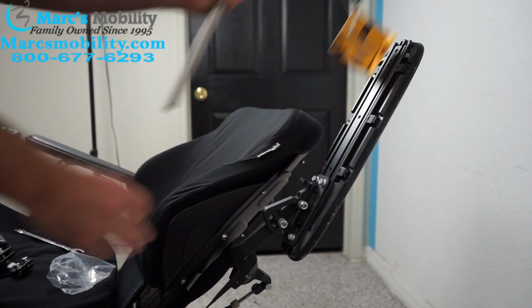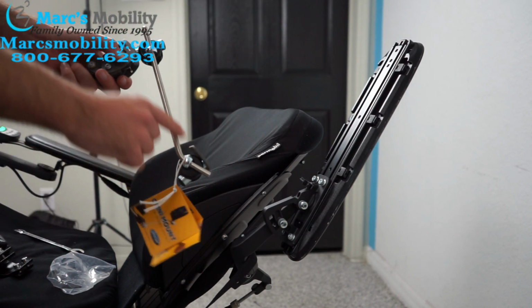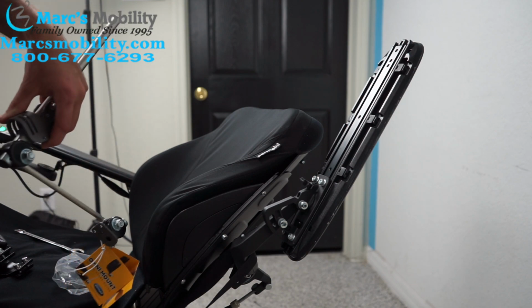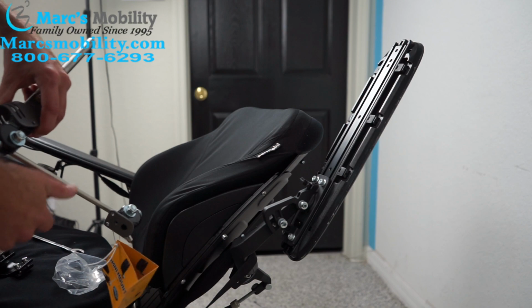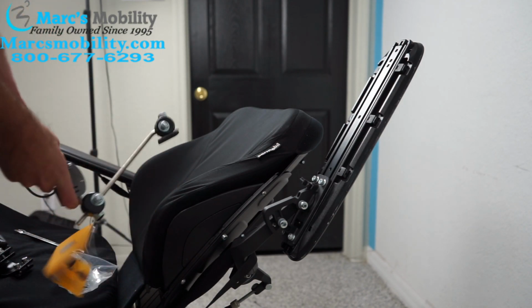So it'll sit in your arm like this. If you want to adjust this control arm, there's a 1/2 inch nut here you would loosen with a wrench, and then you can go forward, backward, in and out. And then same thing with this one, which I will go over in a second.